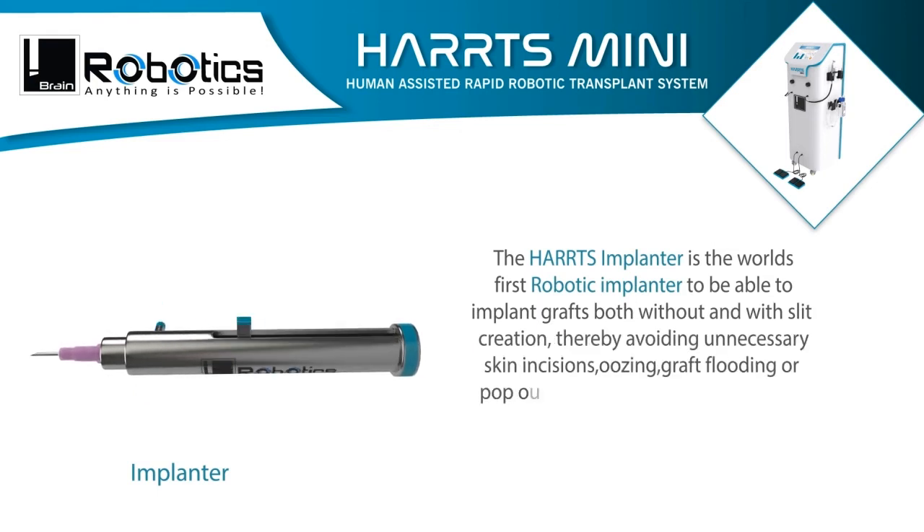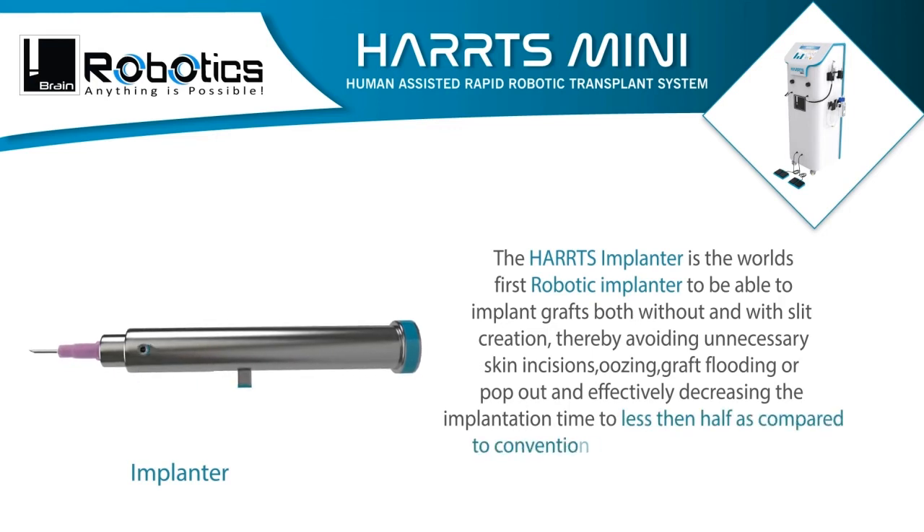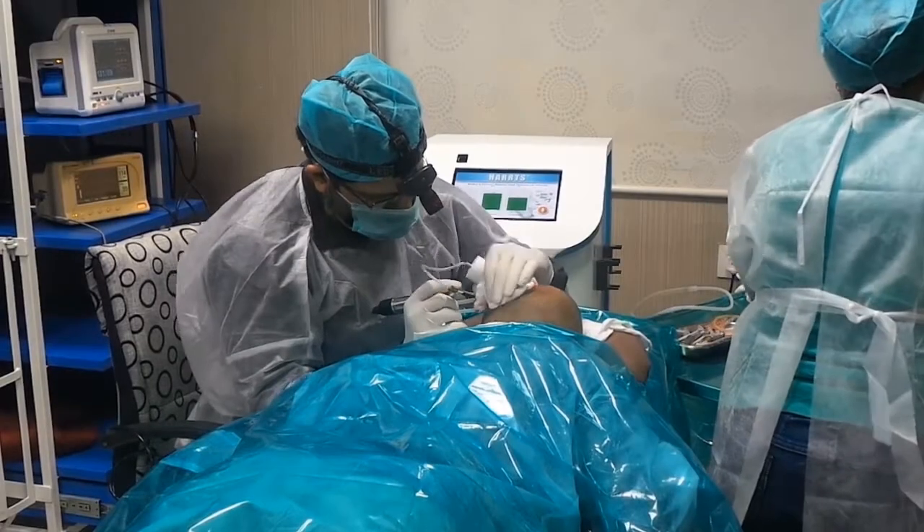The HARTS implanter is the world's first robotic implanter able to implant grafts both without and with slit creation, thereby avoiding unnecessary skin incisions, graft flooding, or pop-out, and effectively decreasing the implantation time to less than half compared to conventional implantation techniques.